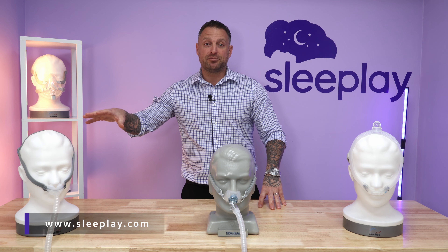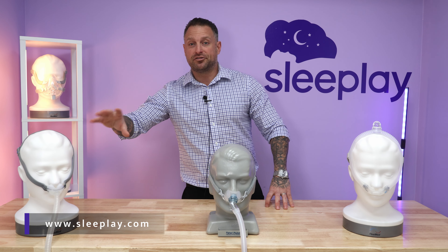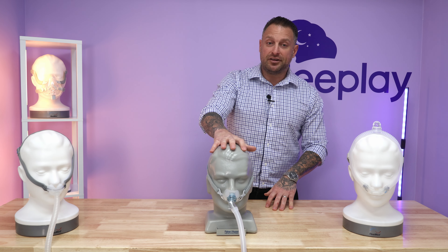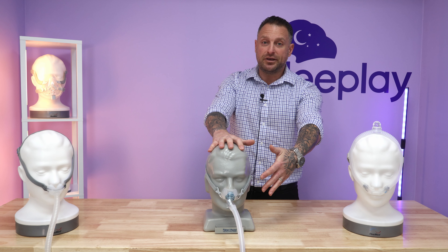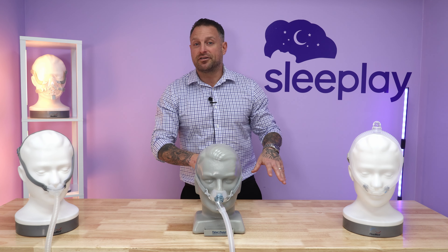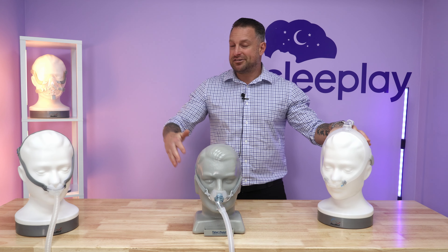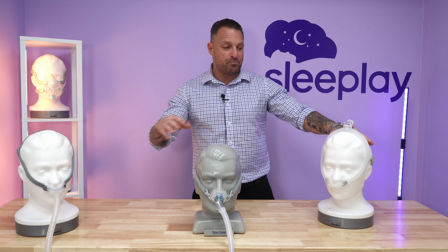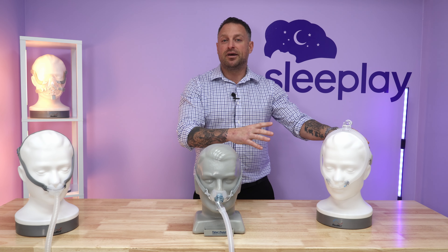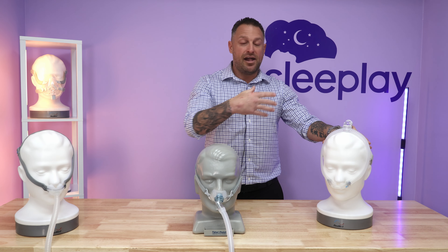So we discussed the P10 mask by ResMed with the foot-longer tubing. These cushions are a little more sturdy and stern into your nose — they fit a little better. The Brevida also has a foot extra tubing with softer cushions and similar headgear. The last mask we're going to discuss is the P30i by ResMed. Now this mask has similar pillows as the P10, but it connects to the top of the head. Everything with an 'i' for ResMed — the F30i, N30i, and the P30i — connects to the top of the head.